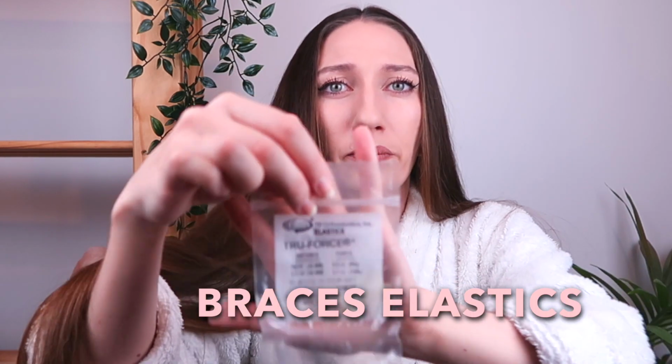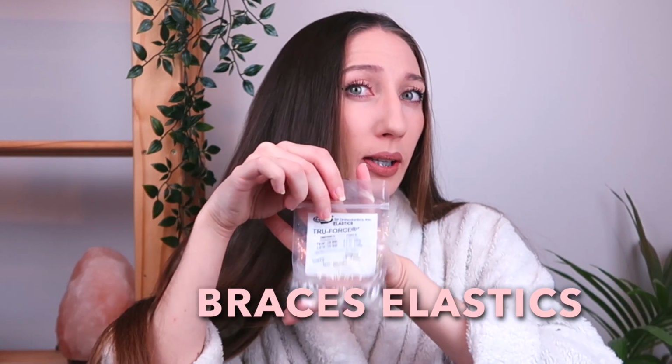And then the other thing I have is my removable elastics. These are not the same elastics as the coloured ones that go on your braces. They're removable, and you get them towards the end of your treatment. These end up everywhere as well. You will find them everywhere in your house. They'll just never not be everywhere. So yeah, these are in the bag as well.